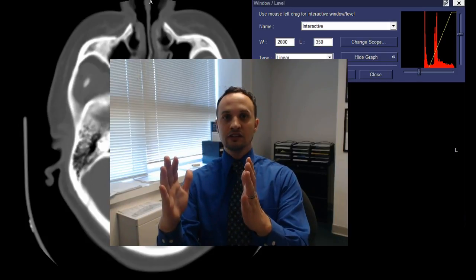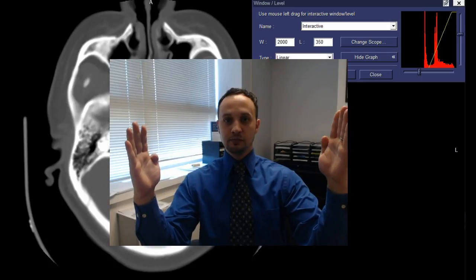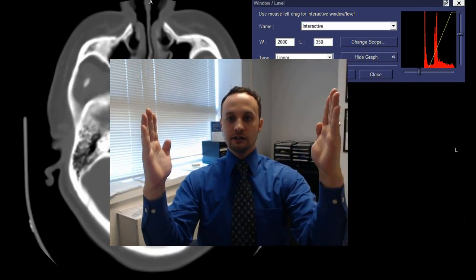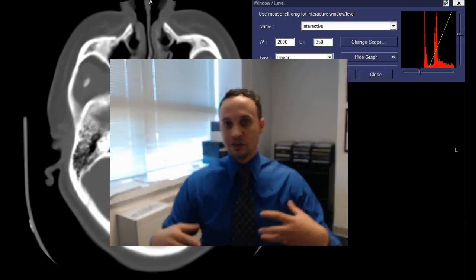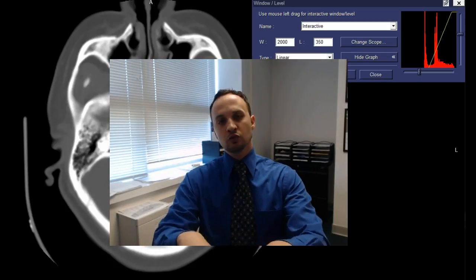manipulate basically our level. The level is the point where it's at on the scale. So if we have a scale that's this big, and we want a level that's right in the center, then that level is the center point here. Whatever our scale is, it's dependent on that level, so whatever we're trying to visualize, and then we can manipulate those values. So the concept hopefully will be reinforced with the following video.